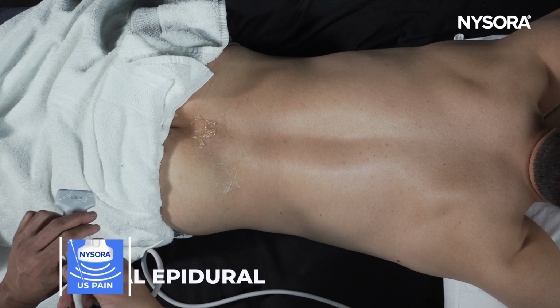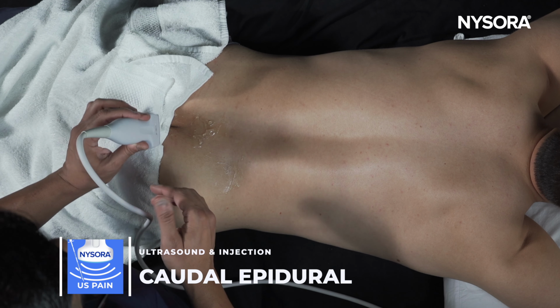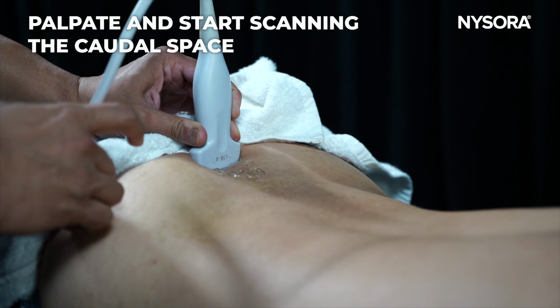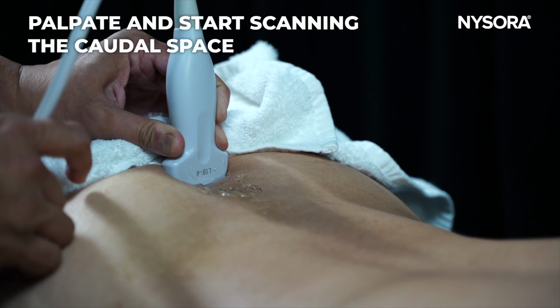I'm going to show you how to scan for the caudal epidural using ultrasound. You could palpate for the caudal space, and then you can put the ultrasound probe on top of this caudal space. That's another good way to actually get to the structure quickly.